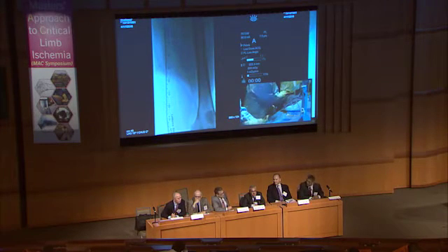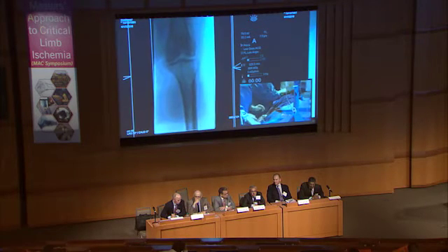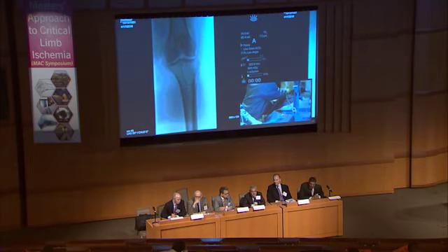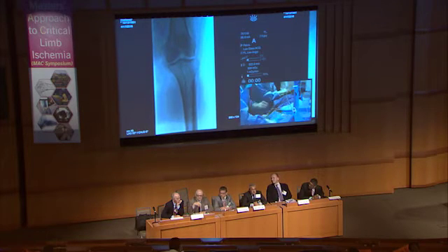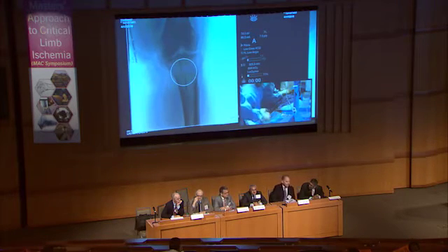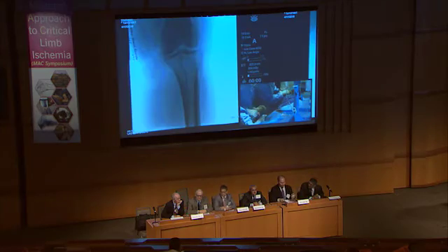Sure, I couldn't agree more, because it's been clearly shown that the thrombotic risk is directly related to outflow integrity, and it's a big deal. So you would go after both of those vessels? Yes, I think so. Well, the tibio-peroneal trunk gives you two outflow vessels plus the anterior tib. So you can address all three. Short occlusions of the posterior tibial and of the anterior tibial are easy to treat with drug-coated or drug-eluting stents, and then he would have a nice three-vessel outflow to the foot.